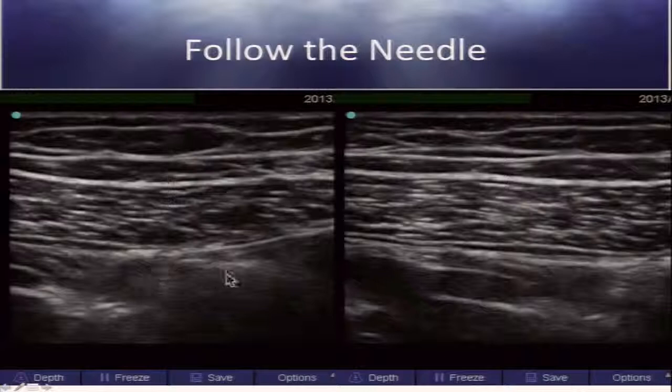These are the vasculature. So this is the lateral margin. It's entering in at the lateral margin. It's going right over all this nerve tissue. It passes along, you can see it here, passing along over the vasculature, and then it goes on to the opposite side as was seen in the previous scan. If you do not put your needle where you want your catheter, it will never end up where it's supposed to be.